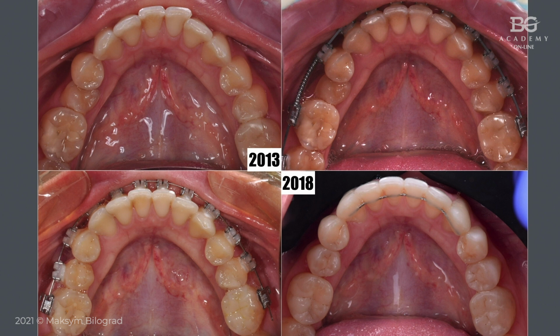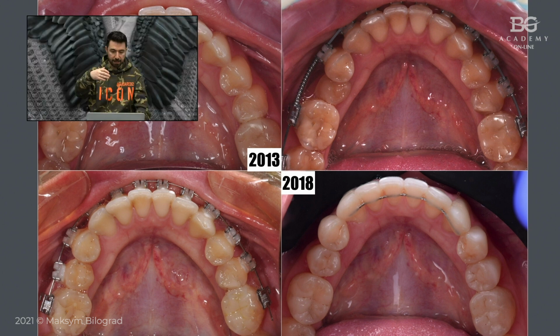We used the stents from the wax-up and restored all of her teeth because of the occlusion. Check on her first image, the molar teeth were worn and also the incisors were slightly worn. So basically after orthodontic treatment we made some adjustments on occlusion, and we used composite materials in copy-paste technique.